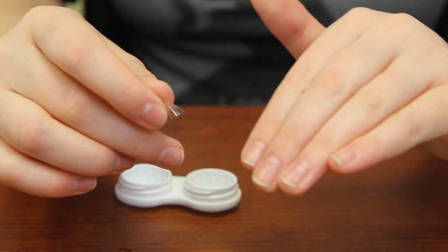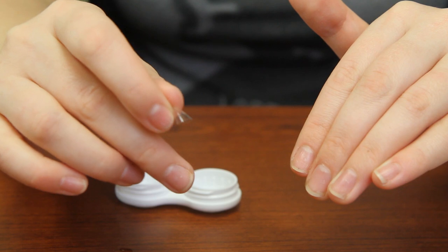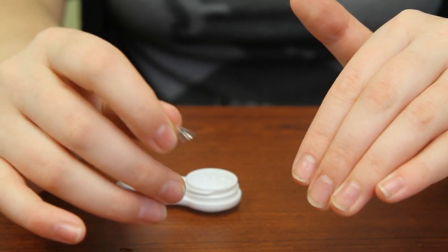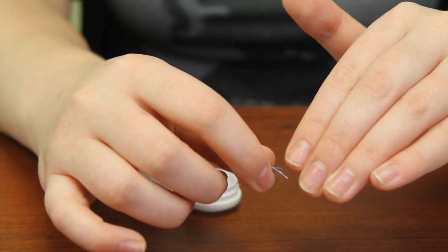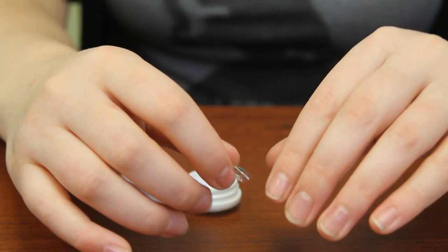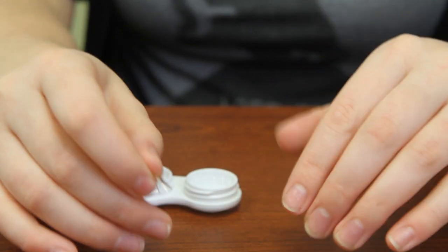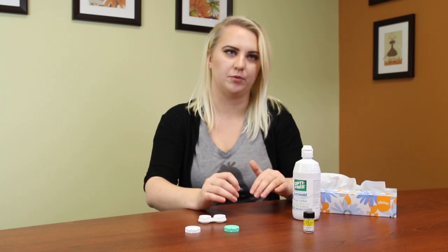You want to use your non-dominant hand to hold the top eyelid. Use your dominant hand — your middle and ring finger — to pull down on the bottom eyelid. You're going to push the contact lens underneath the pocket you created with the upper lid, and then let go of the eyelids gently. Then open up the eyelid again just to make sure that the edges aren't flipped, because that can be uncomfortable for the child.